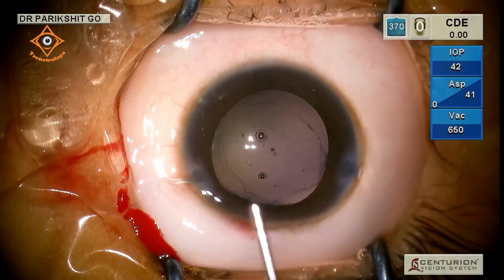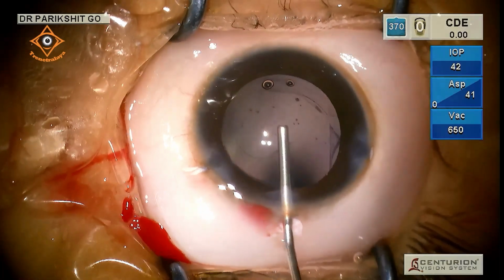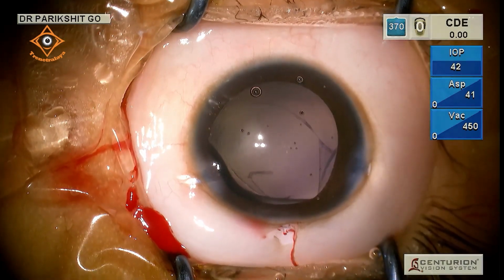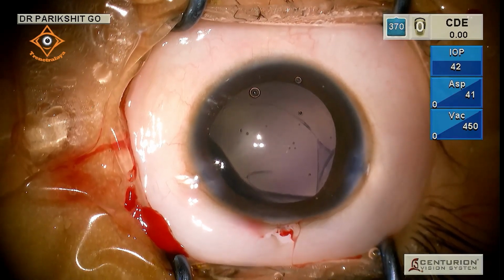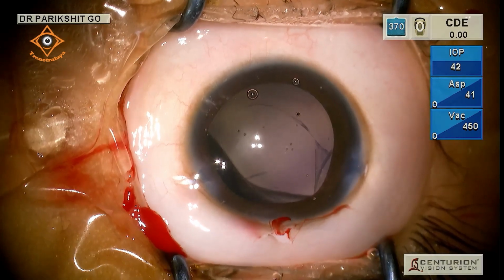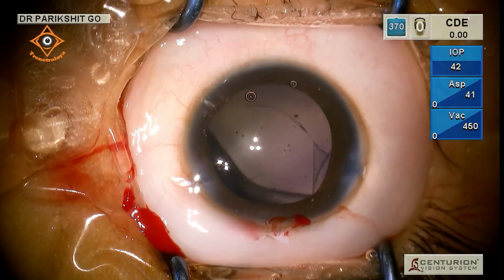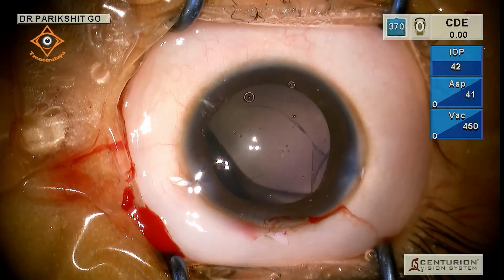So at this age, we would have perhaps done a 20% reduction. So if we wanted to make this child really emmetropic, we would have perhaps thought of putting in, say, a 5 less, so about 23 the IOL. But the problem would have been the child would be very, very hypermetropic, about +4 or +5 for distance, almost +8 for near, which would not be good. So it's not a great undercorrection we have done, barely about 5 to 7%.